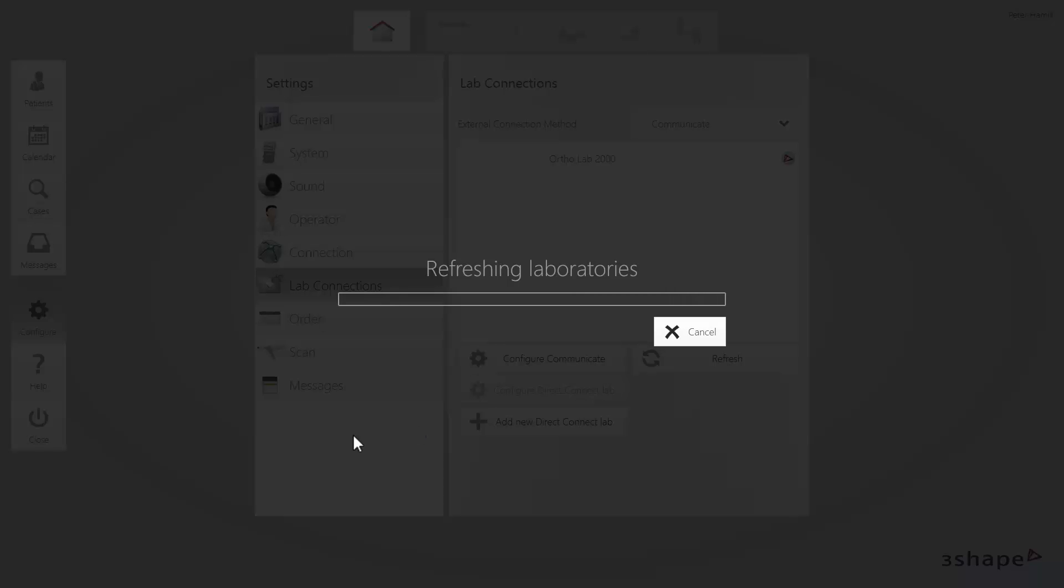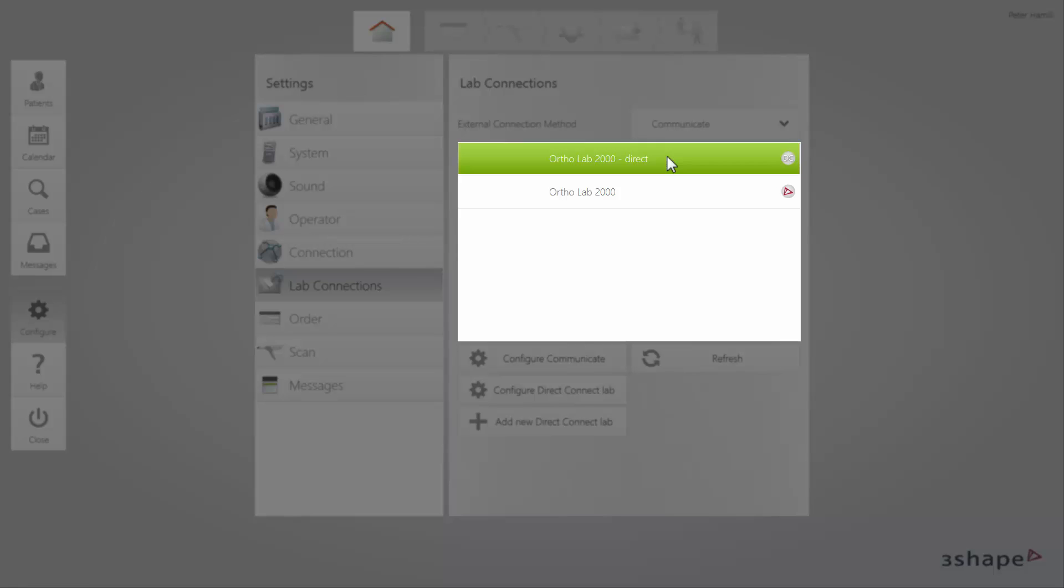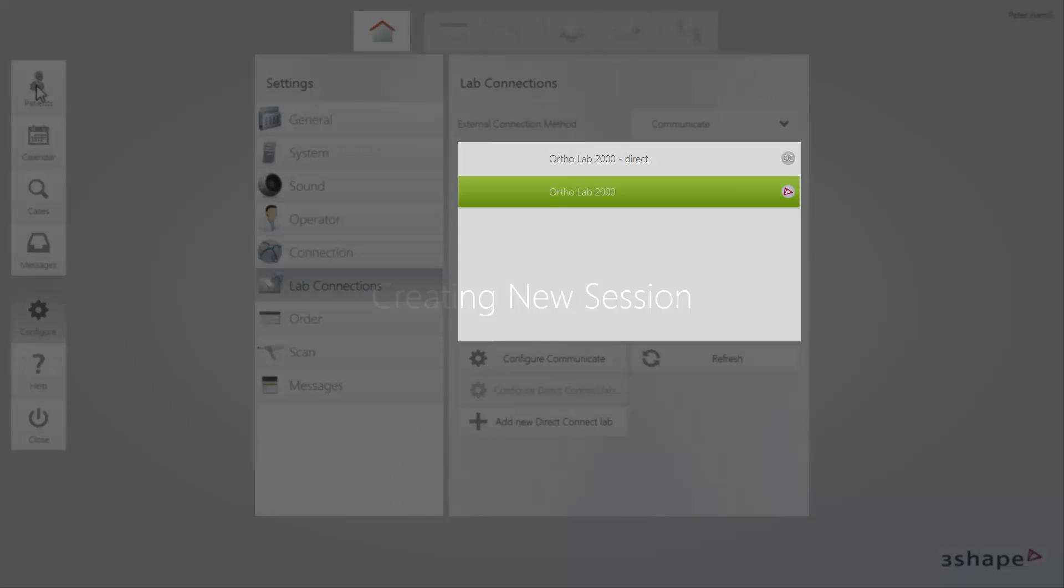Now all the connections, including both TRIOS Direct Connect and TRIOS Communicate, will be seen on the list shown in the Lab Connections menu. Different types of connection are distinguished by icons.